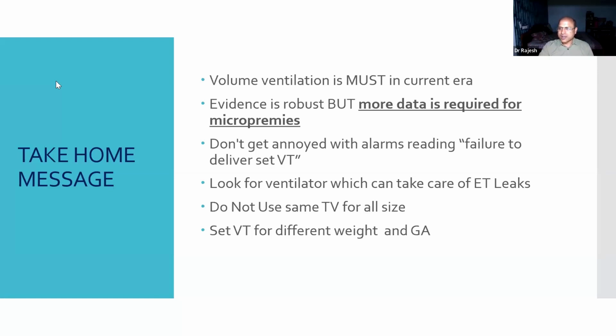So, Rajesh, any comments? Hello. Yes, Rajesh, I think you are right. What I want to highlight, as you have already told, is that people should know whether their flow sensor is working or not. Many times we find the ventilator is running, but the flow sensor is not working. That's why, if you see only the pressure scalar with your proximal sensor and there is no flow or volume, that means your flow sensor is not working. Many times people do not know it is not working.